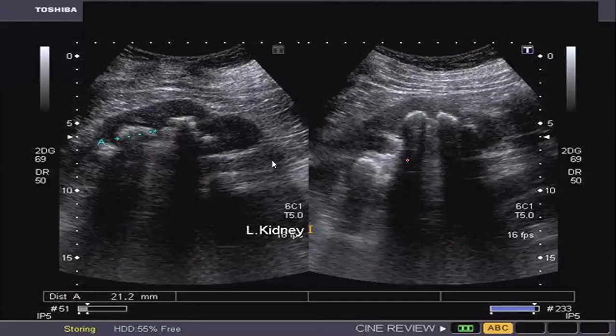You will only learn that if we discuss why in pleural effusion, for example, it is white on X-ray, but black on ultrasound. You have seen examples of that. So, I will explain some other time.